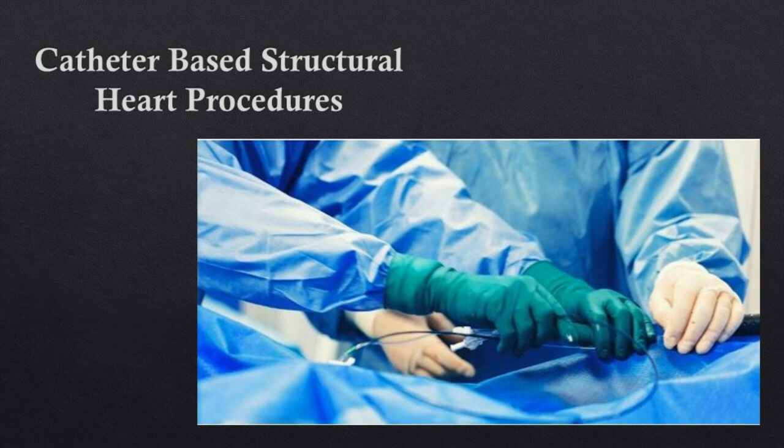Very similar to cardiac catheterization labs, structural heart disease procedures are performed through catheters as well. A variety of instruments are passed up through the heart and used to deliver treatment devices. And these devices are typically placed through catheters in the leg. For example, in patients with diseased heart valves, a new valve is passed through a catheter and secured into place. This incredible device technology allows these valves to be passed up to the heart in a highly compressed state, so it can pass through a catheter, and then when in the correct position, it can be expanded appropriately to the desired size, where it becomes a new, fully functioning valve.